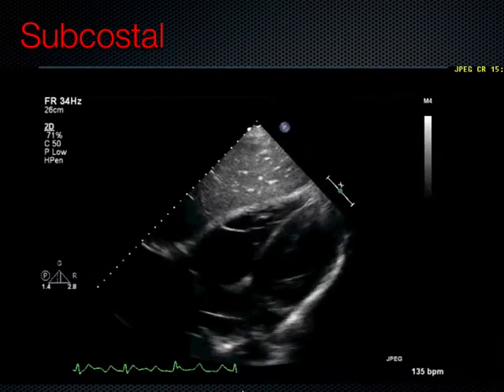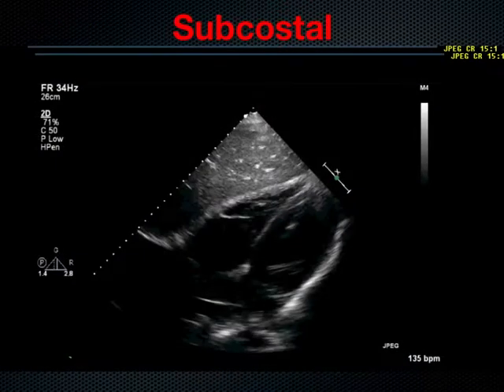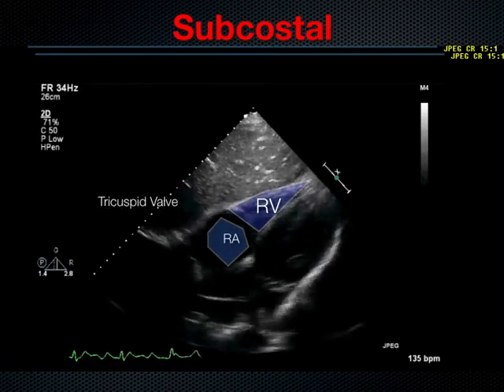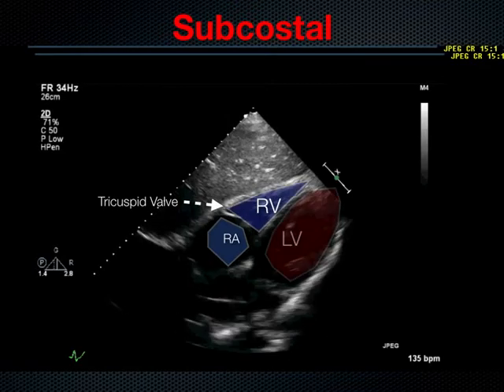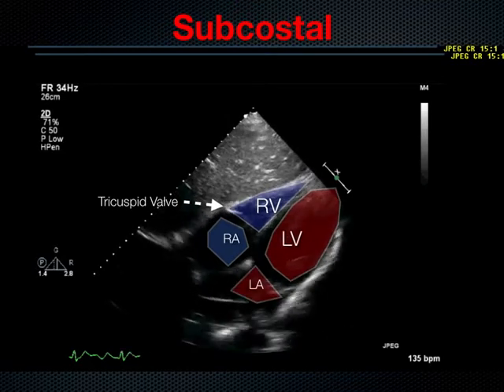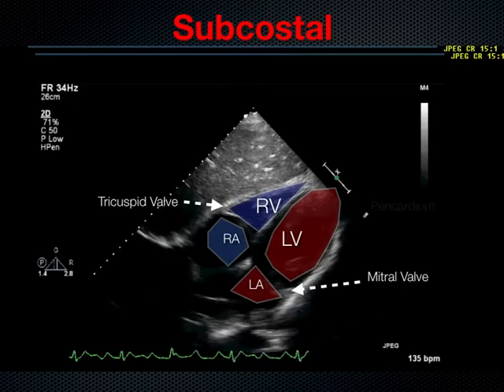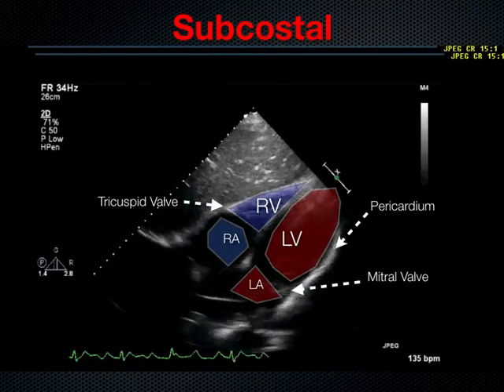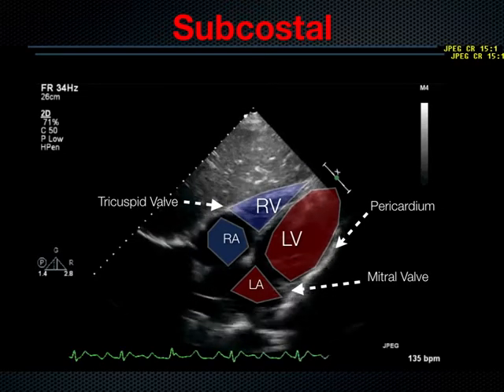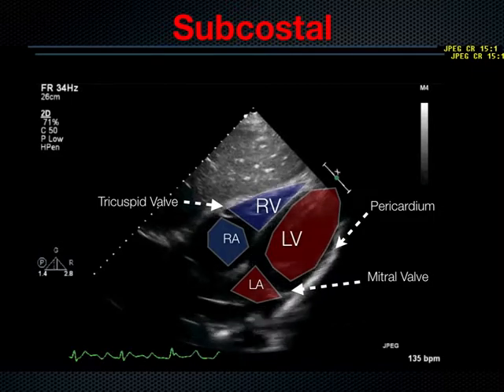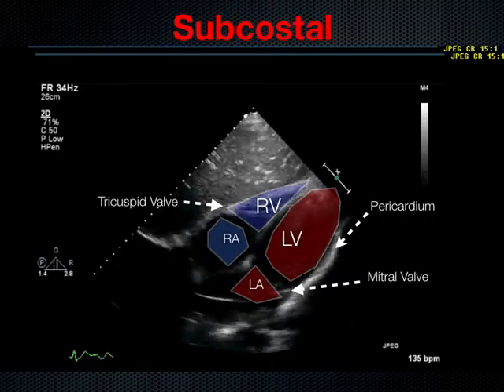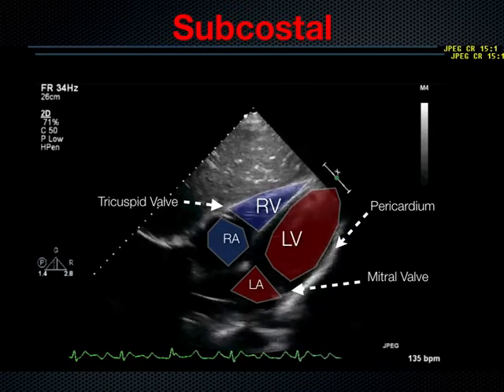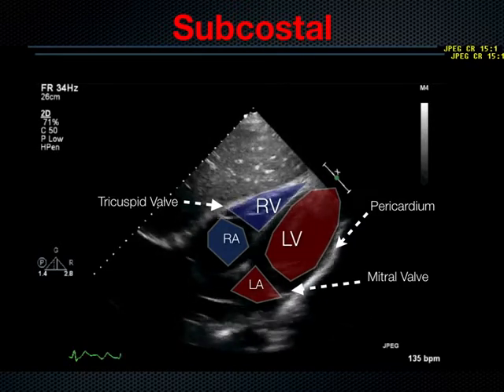In more detail, we have the right ventricle and right atrium with the tricuspid valve between, the left ventricle, left atrium, and the mitral valve between. The bright white pericardium circles the heart. There are two layers to the pericardium — the visceral and the parietal — which are normally together without visible fluid between them. When evaluating pericardial effusions, the two layers are separated by fluid, giving a white-black-white pattern with the fluid appearing black.